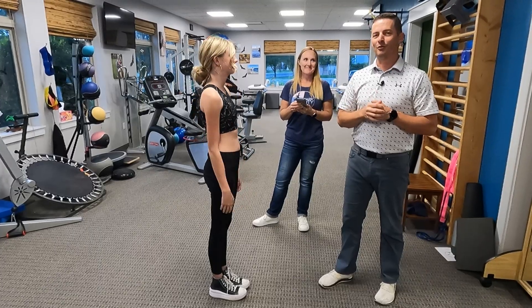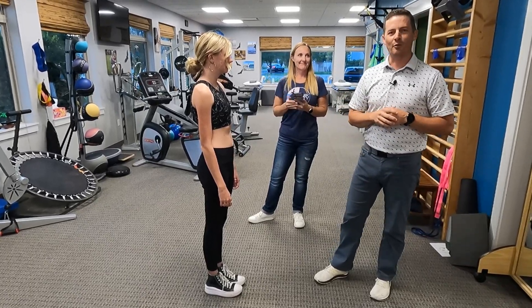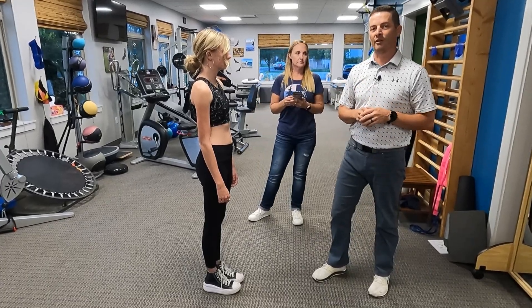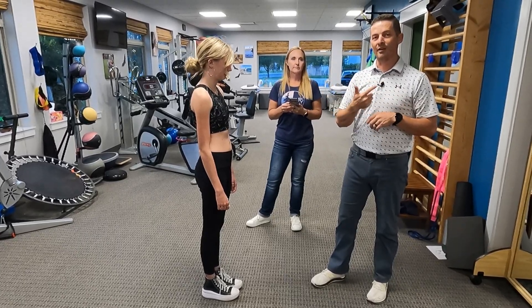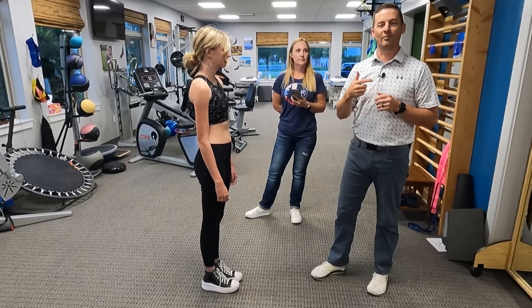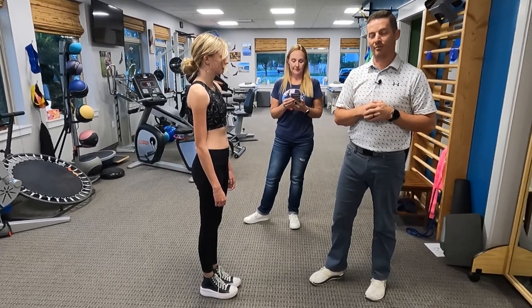Addie has been gracious enough to let us use her back as a model for using the Momentum Spine app. A couple of things — feedback I've had from patients is make sure you're in an area that has enough room to walk around the person. With the Momentum Spine app, you're going to go around three times, and you want enough space to actually move around. If we don't get a good scan, it fails and you have to do another one, so it's best to do it well the first time.